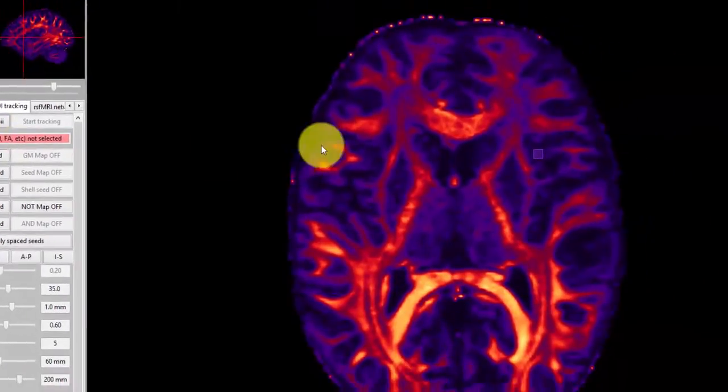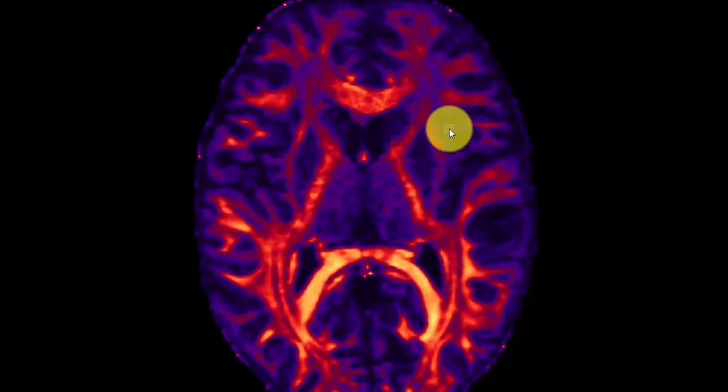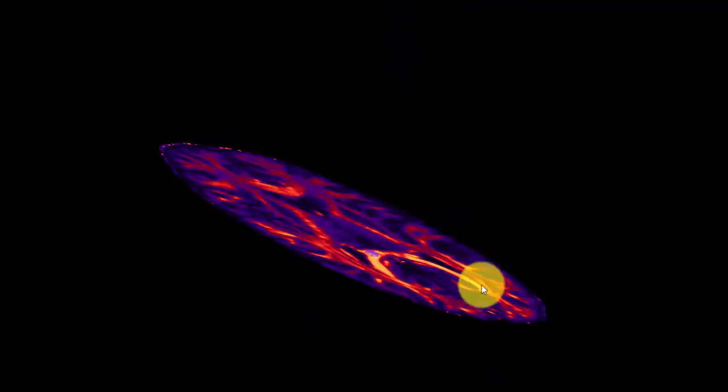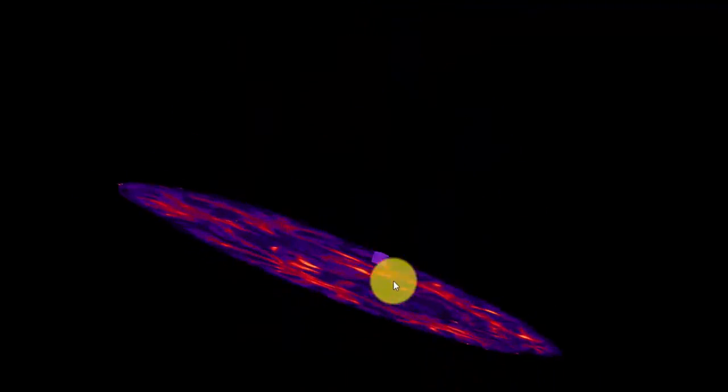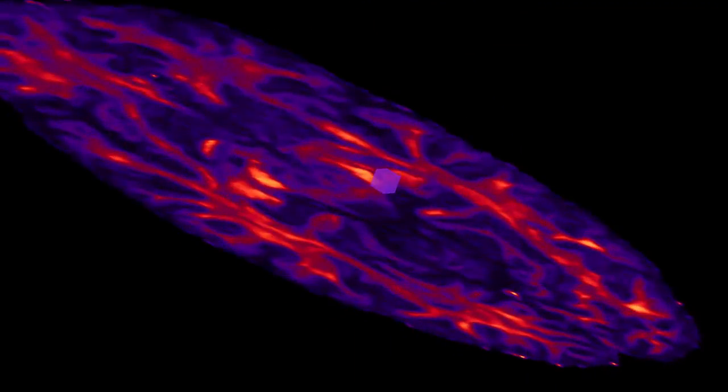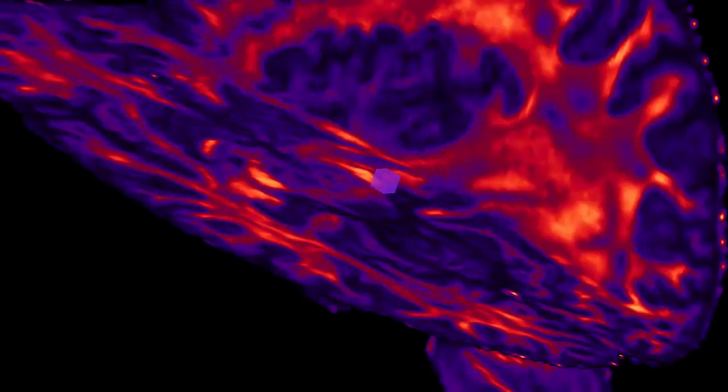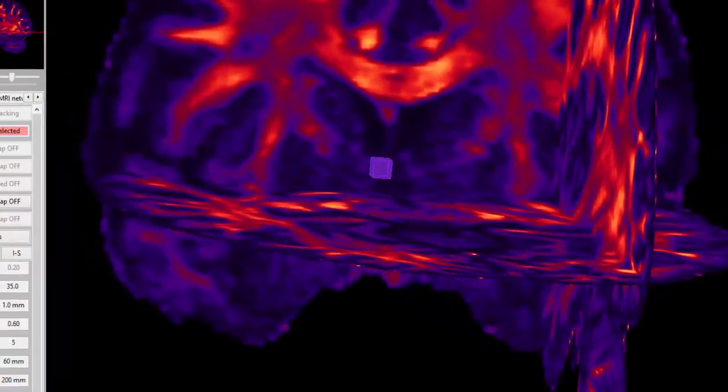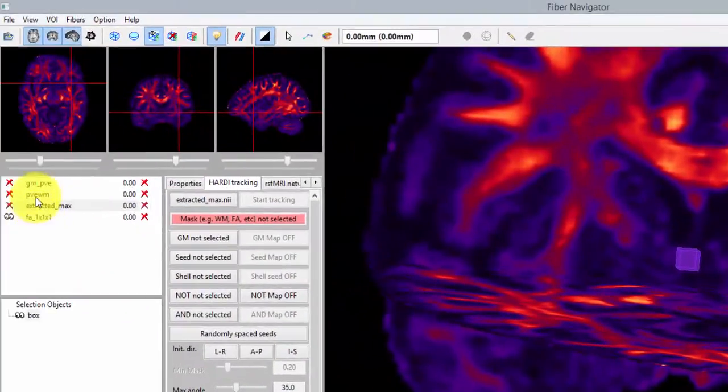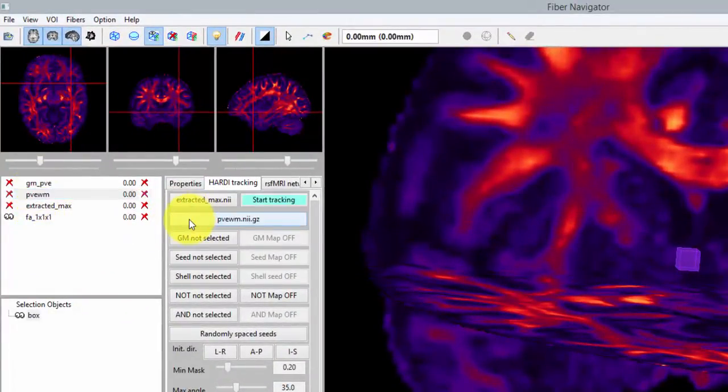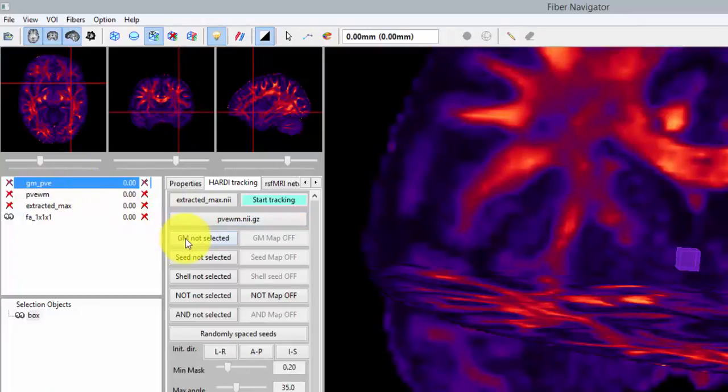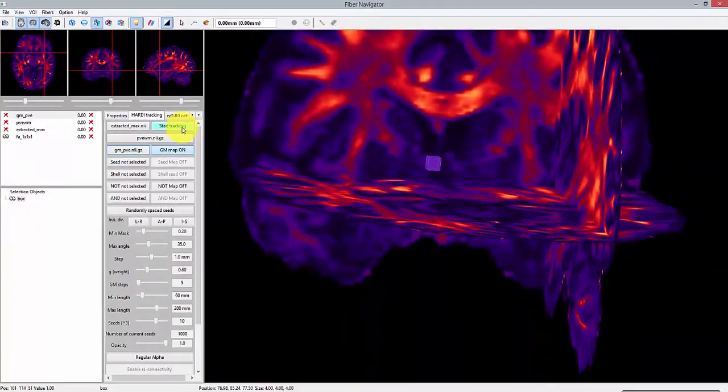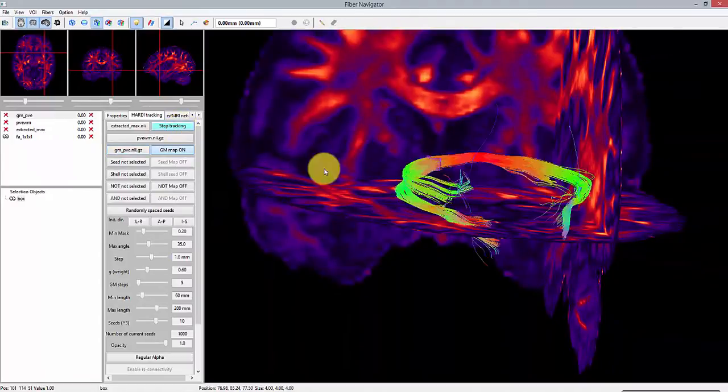So we first need to go to the tractography panel and select our peaks dataset as input. This will instantly create a seed region of interest represented by the purple box. To move the seed region, just right-click on the box. Then we're going to give our white matter mask and gray matter mask to the algorithm and we are ready to initiate tractography.